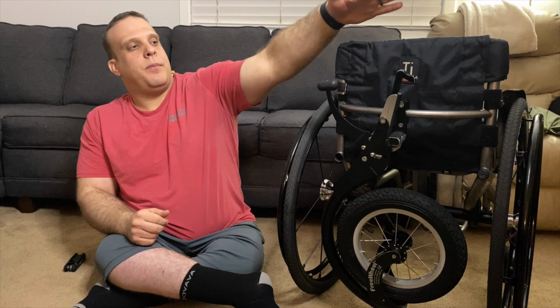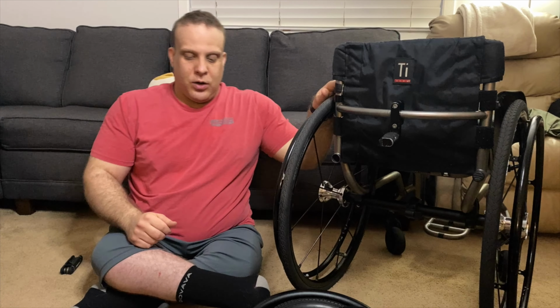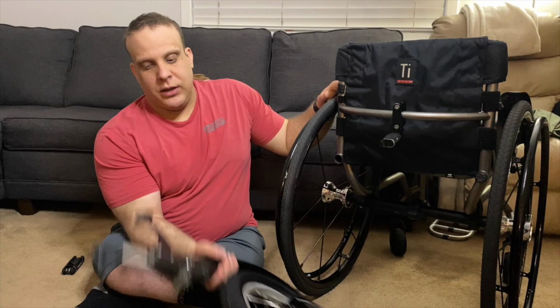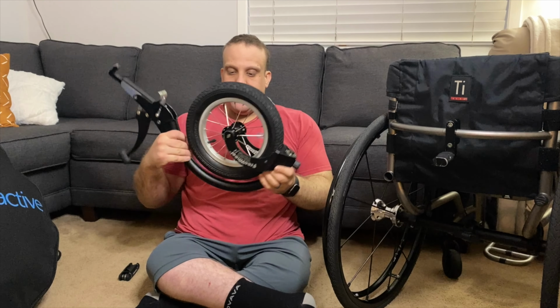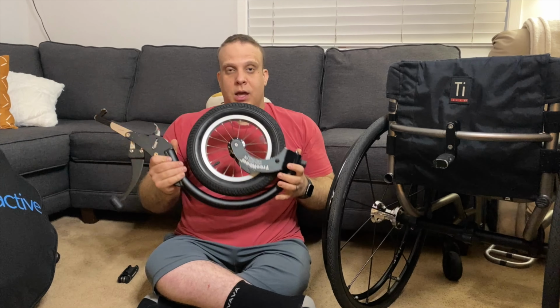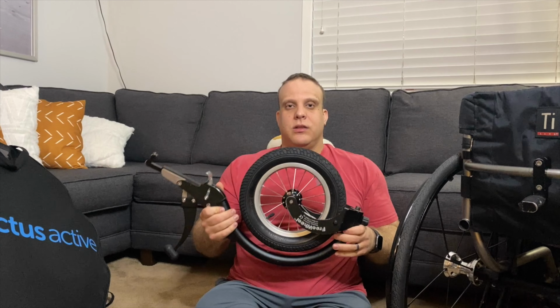I used to have it up higher and my backpack would hit this and it would release and fall. So as long as you make sure you have it set up so you don't hit that, you should be set. So that's the Freewheel. It's a game changer for me on the beach. It really makes a difference to make sure those front wheels aren't digging into the sand so much.